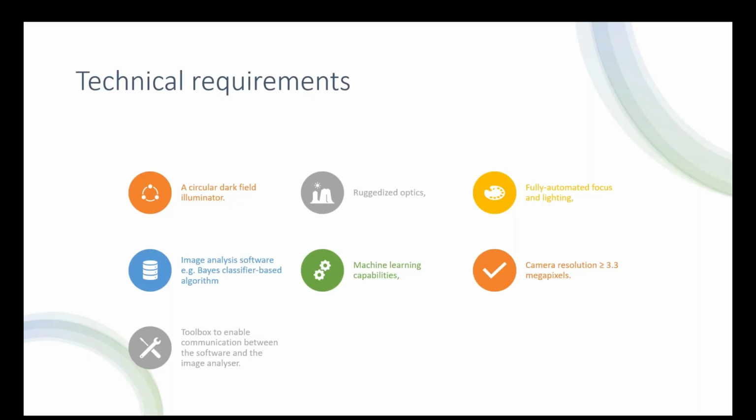The software and the algorithms that drive it need to be suitable for interpretation, and if we can have something that even learns over time, and if we do need to make the occasional correction, that then becomes inbuilt into the system going forwards.